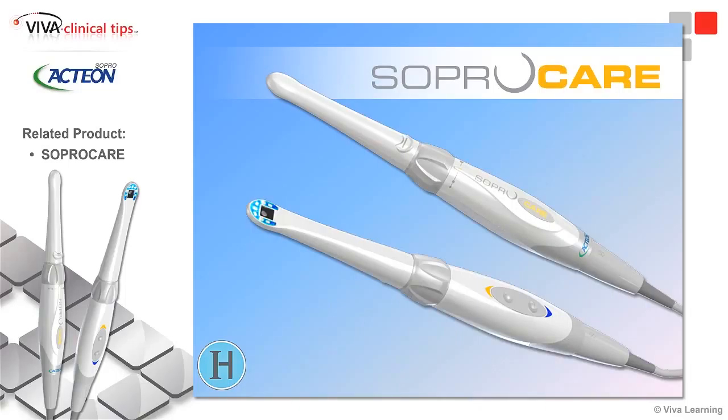You can take a half arch at a time, full mouth bites, and then you can switch it to this close-up view. It has a little guide that goes with it so that you have a steady hand and you can just slide it, rest it on the teeth. It's autoclavable, and that little sleeve fits over the end of the camera, and you just rest it on the tooth and you slide it as you're taking the images. There's also a foot pedal that you can push if you want, or there's a little hand control if you have an assistant that can help you with that.